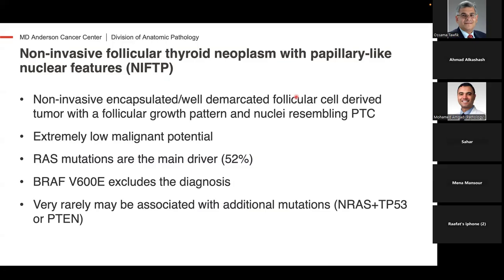And the reason is because of sampling, right? You can sample the entire tumor, but you're not looking at the entire tumor, right? So you might have missed an invasion that is not apparent on the slide. So that's why sampling and levels on the slides are very important.